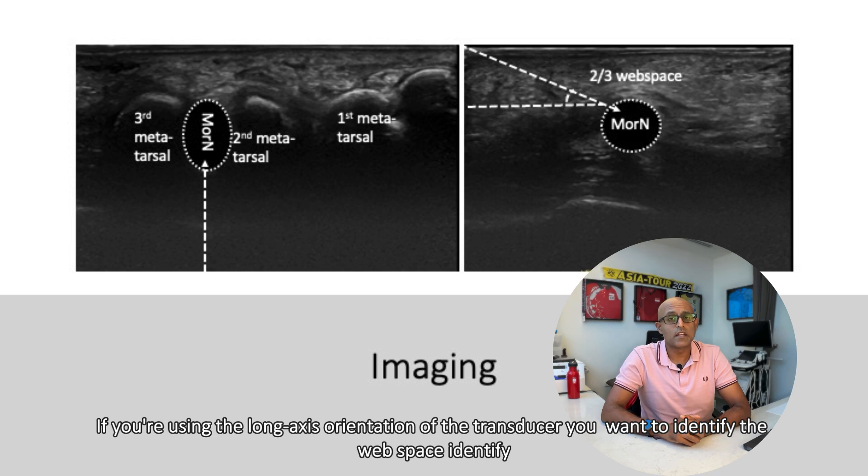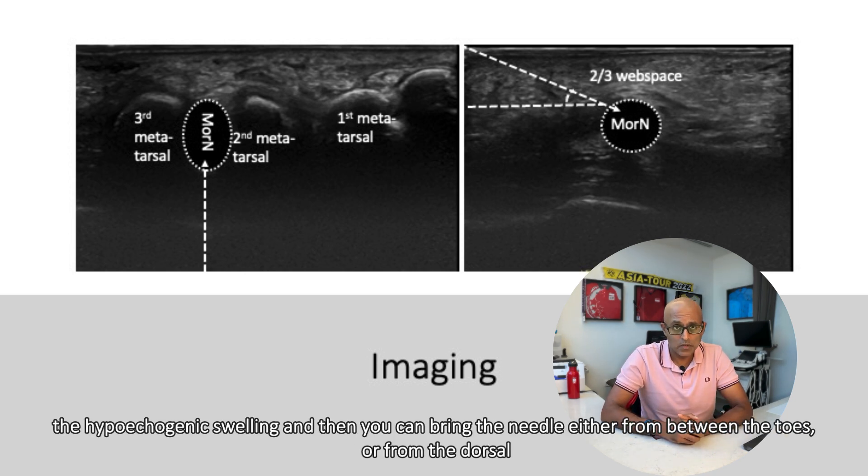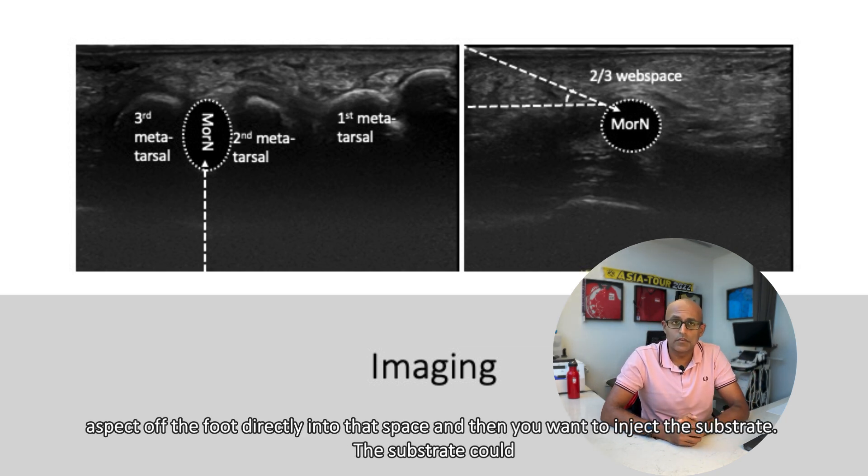If you're using the long axis orientation of the transducer, you want to identify the web space, identify the hypoechogenic swelling, and then you can bring the needle either from between the toes or from the dorsal aspect of the foot directly into that space, and then inject the substrate.